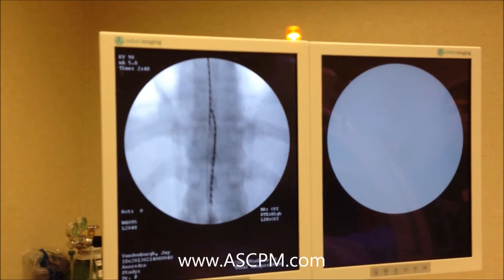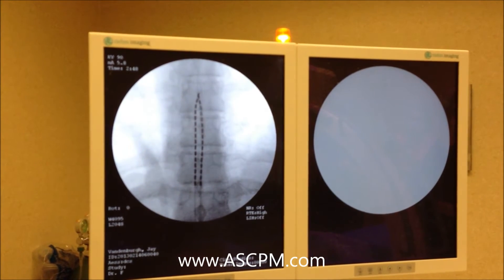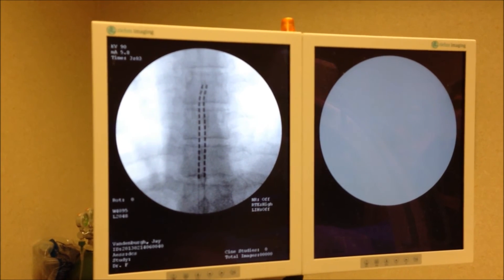We're going to go right up and park this right next to the other one. And those look beautiful. Leave it there.